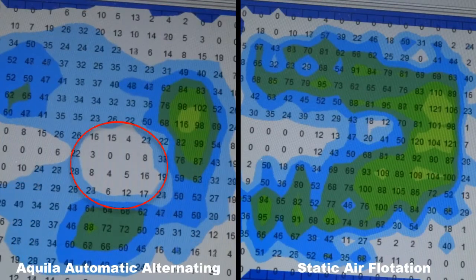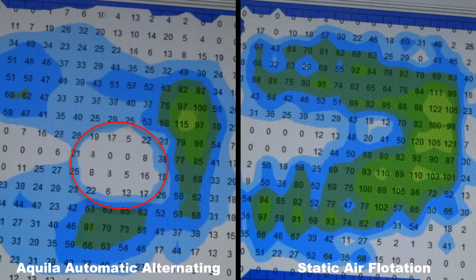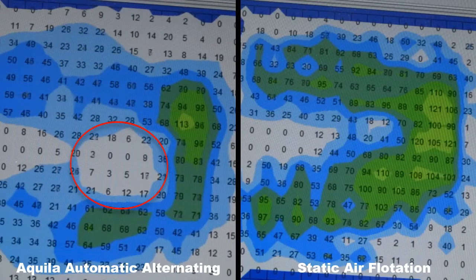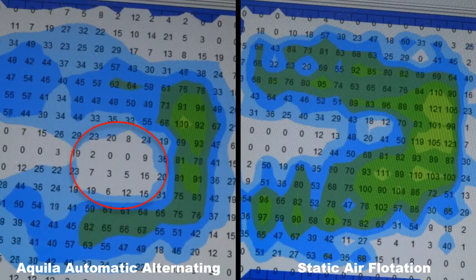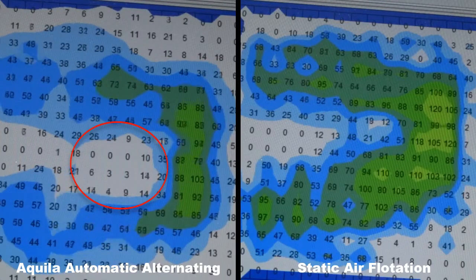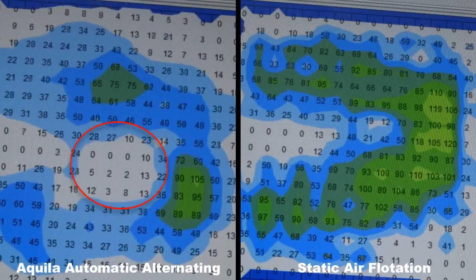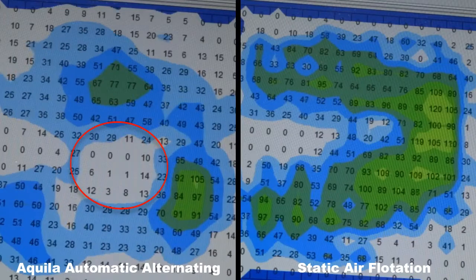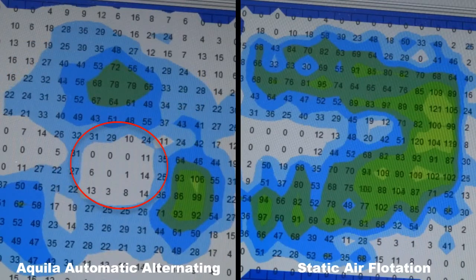It automatically inflates and deflates two groups of internal air bladders to create movement without any help of the person on it. The movement, the alternation, is automatic and continuous while the system is being used. You can see the image on the left changing as the Soft-Tack cushion's automatic action takes place.